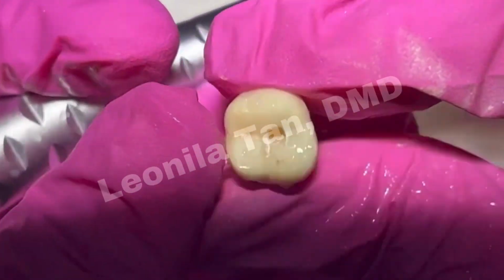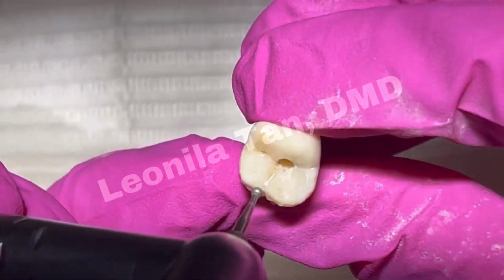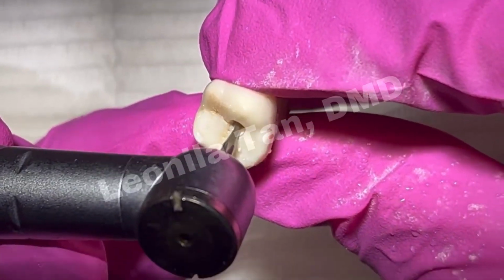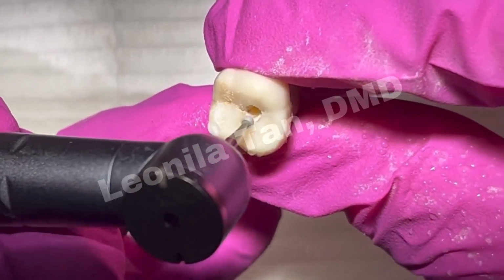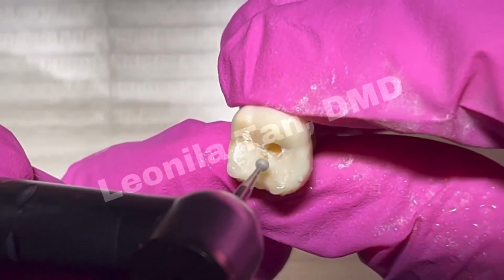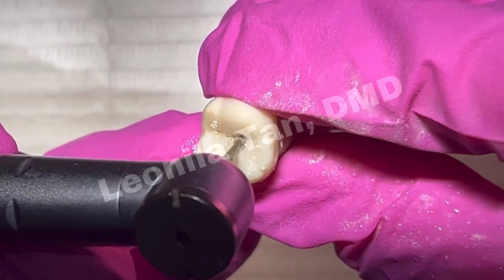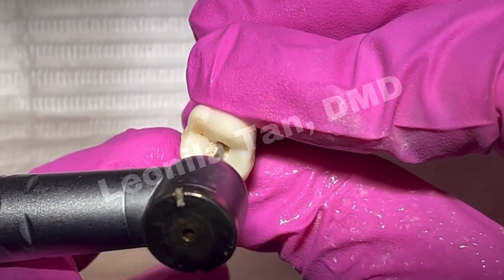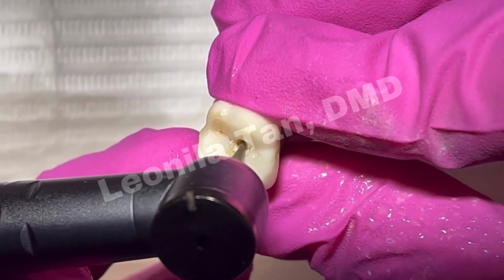You never do a flattening movement. So as you enter, again, touch and go motion.